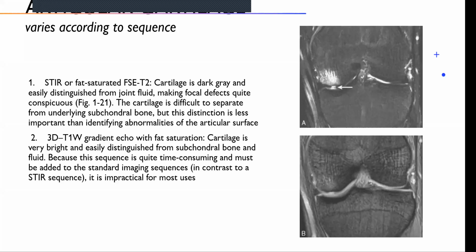The local gadolinium will affect that because they need an enhancement within the arterioles. The idea is that we have a group of arterioles there. So when you give a systemic gadolinium and then you wait for, I think, half an hour or something like that, there will be an enhancement within the tissue that you want to do an MRI. So that's why a gradient echo with fat suppression and then with the gadolinium study, we'll see how the picture will be elaborated.